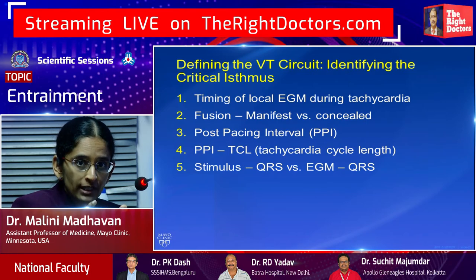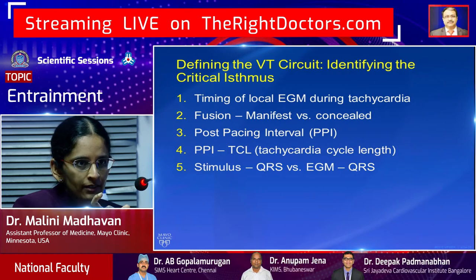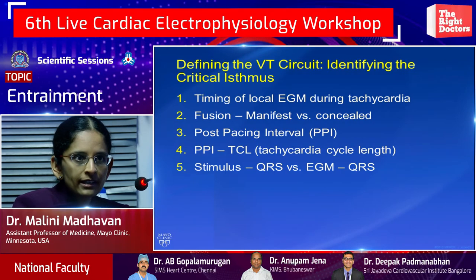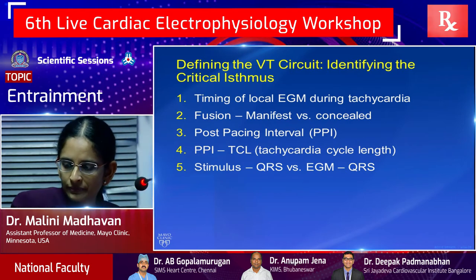So you want to measure that and then compare it to the tachycardia cycle length. And then finally, you want to look at stimulus to QRS and electrogram to QRS, and we'll go over some examples for that as well.